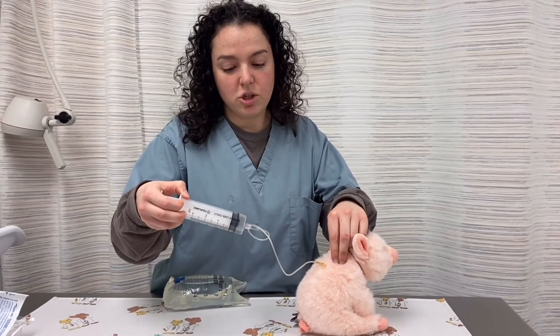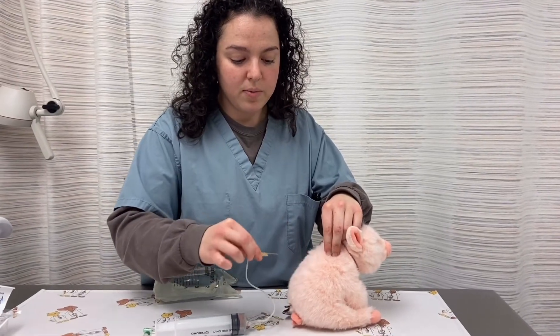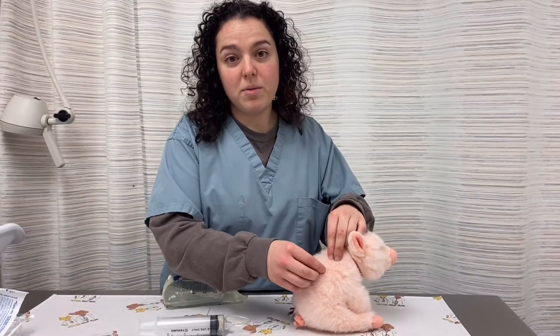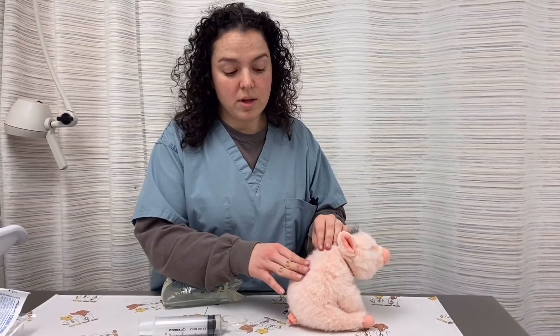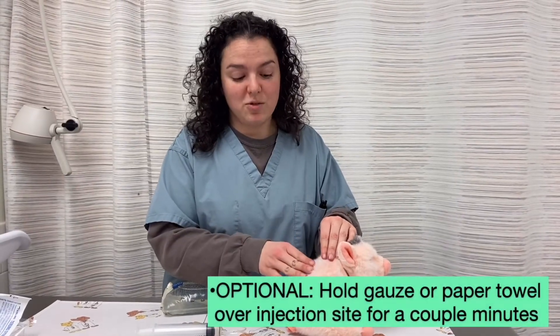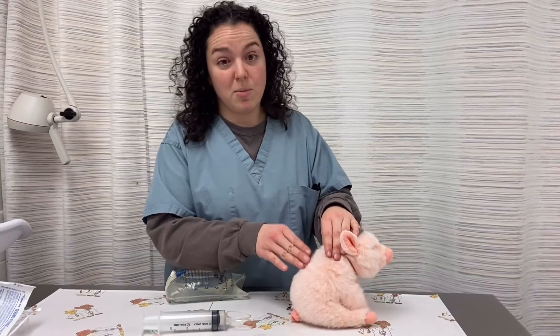Once you have finished giving all the fluids that you need to, pull the needle straight back out. Sometimes blood or fluid might drip out. That's totally normal — it just means you might have hit a small skin vessel. You can use gauze or a piece of paper towel to hold onto the spot for a few minutes, and you should not see any more bleeding.